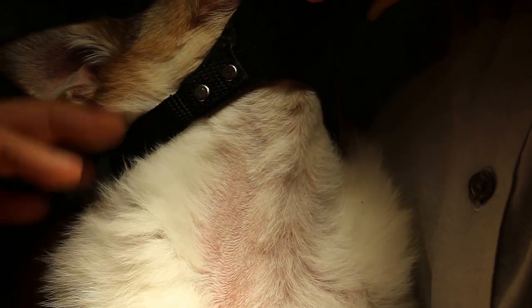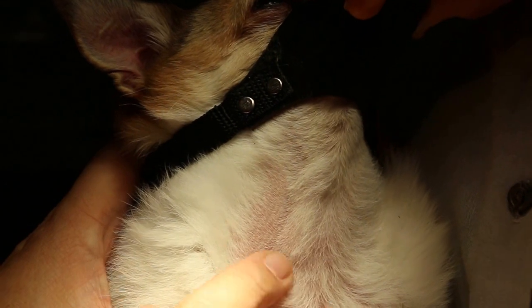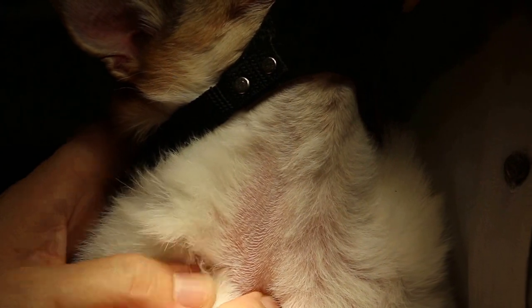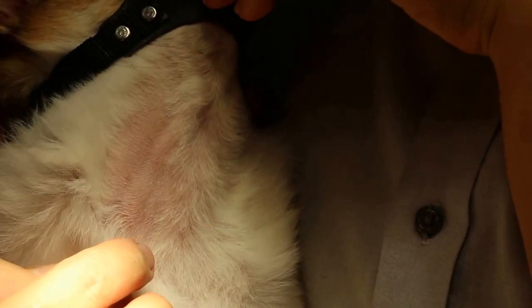It's just like the racehorse. The jugular vein — you've got to press the groove. You press the groove. Give me the alcohol first. Shave the hair up. The assistant holds the mouth up, and if the assistant does a good job, you can see that there is a vein — the jugular vein.